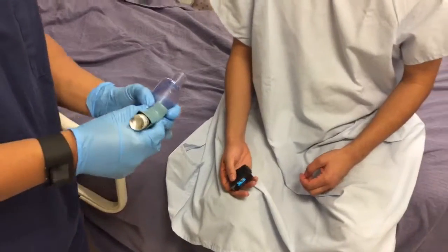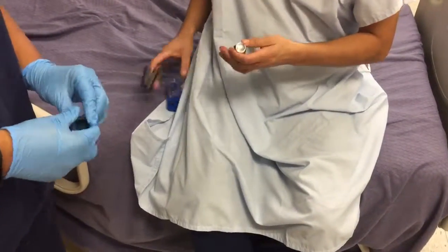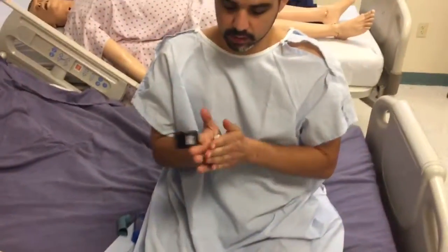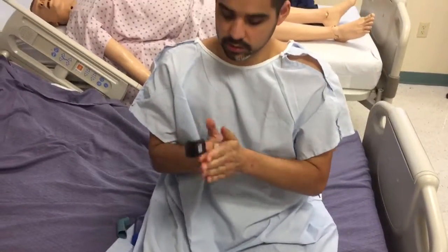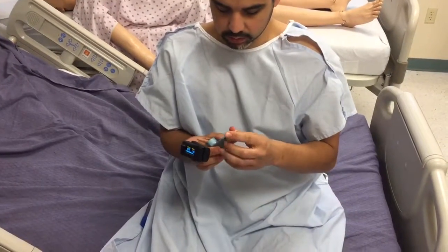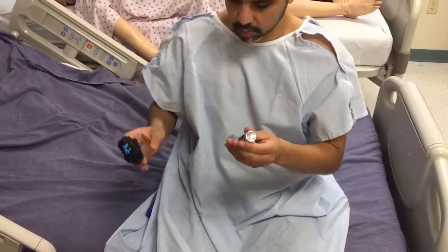Sure, I'll demonstrate it back. If this is brand new, I'm going to warm this up in my hands. This will allow the drug to be ready. Then I'm going to pop it back into my inhaler and take off the cap.